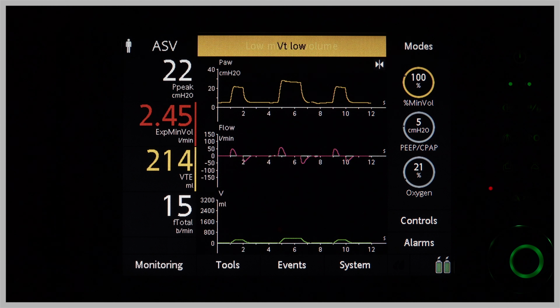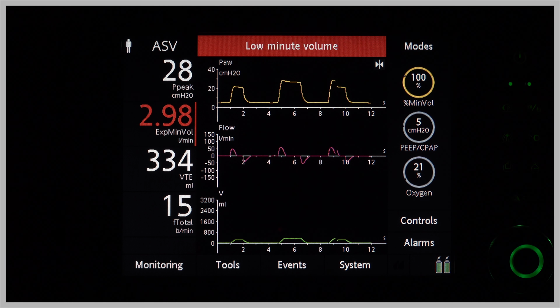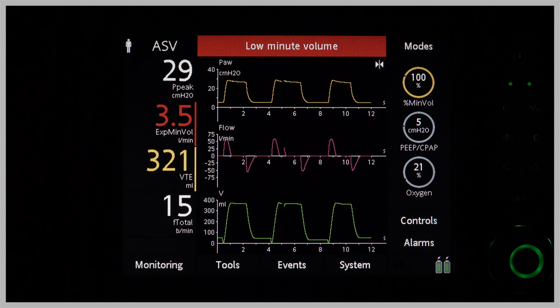Imagine you are monitoring a ventilated patient when suddenly alarms of various priorities sound. Lights flash, alarm noises blare, and your head feels ready to explode. Oh my goodness, the horror. Unruffle your feathers, put your coconut back together, and let's figure these alarms out.